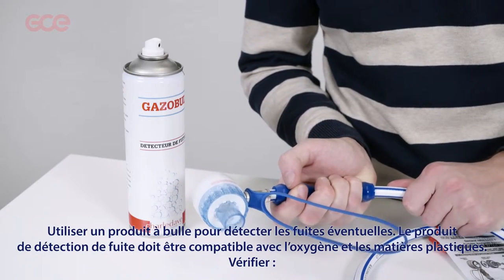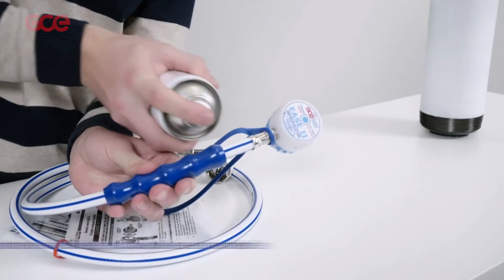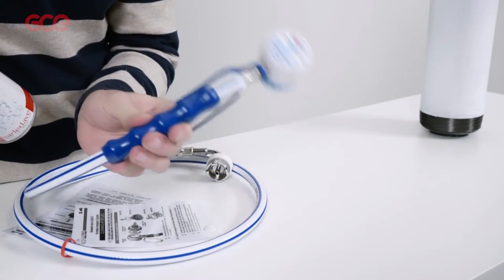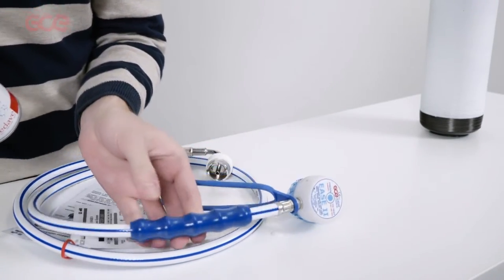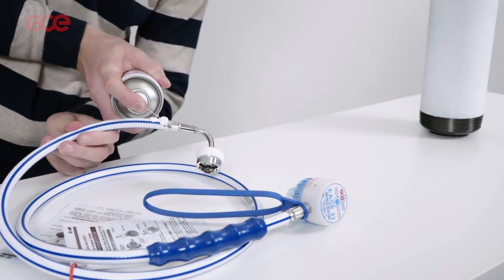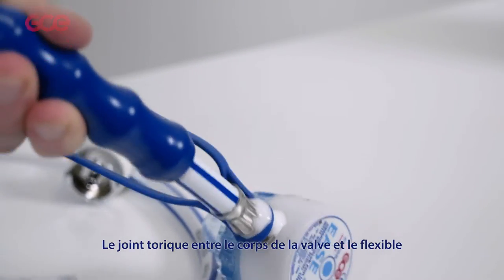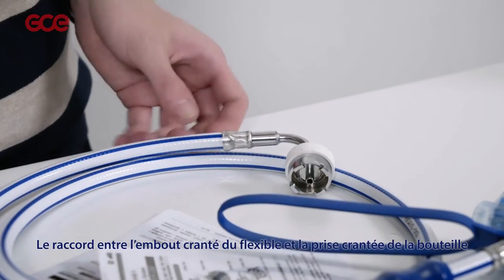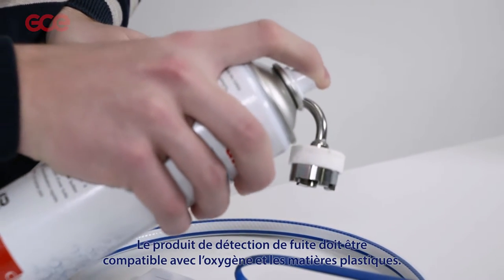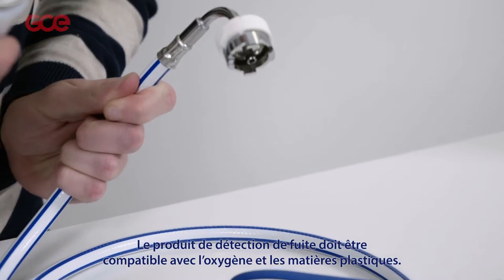Using a suitable leak detection fluid, check for leaks at the joint between the hose and the hose fittings at each end of the hose, the swivel joint between the demand valve body and the hose fitting, and the connection between the hose probe and the gas supply point. The leak detection fluid should be compatible with oxygen and suitable for use on plastic components.